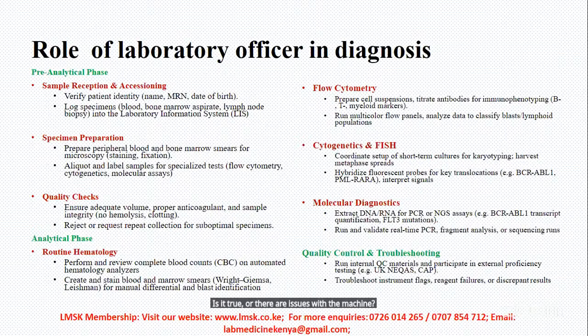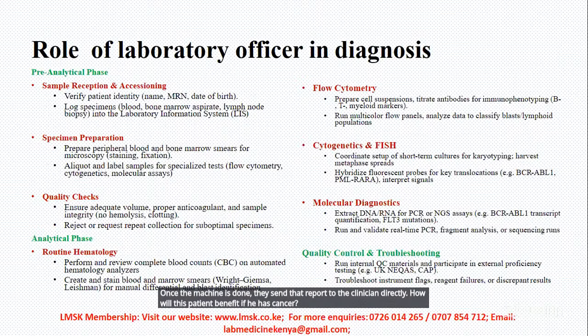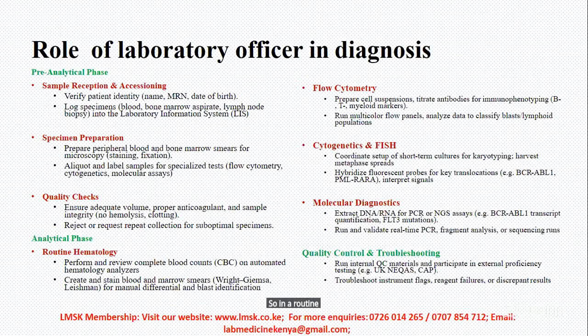And others don't even review those. Once the machine is done, they send that report to the clinician directly. How will this patient benefit if he has cancer? So in routine hematology, you have to review.